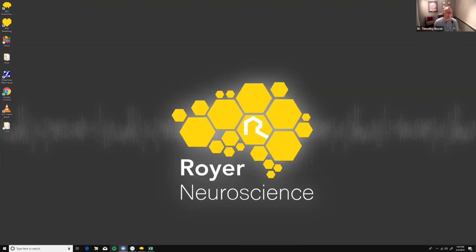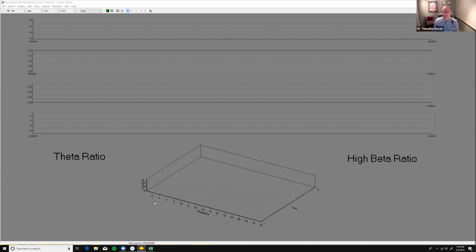So I'm going to start with sharing my screen and showing you the raw EEG. Here is one of our screens. You guys are used to seeing certain types of screens, but this is just another one that's collecting data. In this EEG screen, I'm going to let the raw EEG run so that you can see it. Normally, you're used to seeing just a couple numbers that come up on the screen, but I want to talk to you today about how those numbers translate into real live symptoms and things that are going on neurologically in the brain. So let's run the EEG for a second.